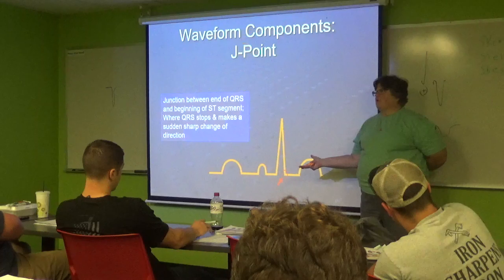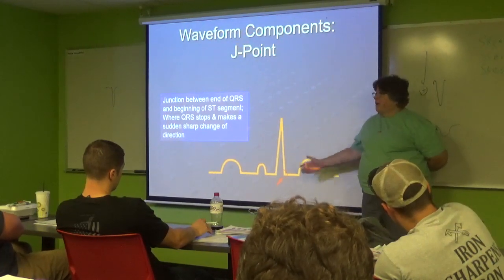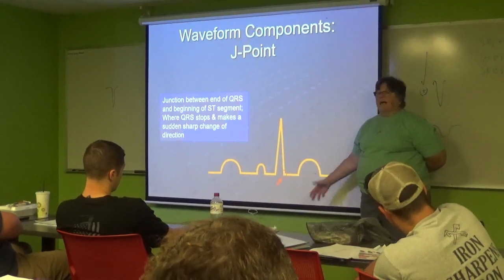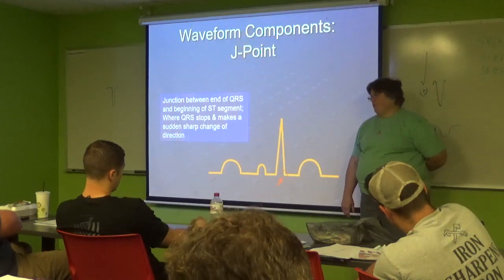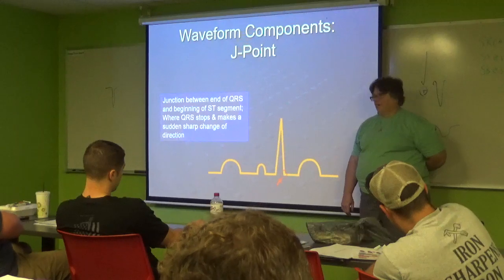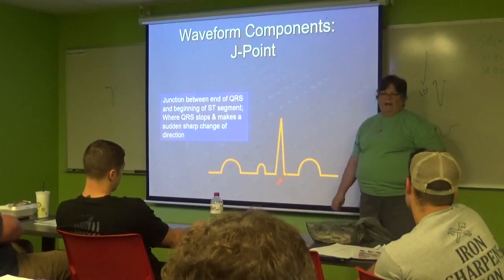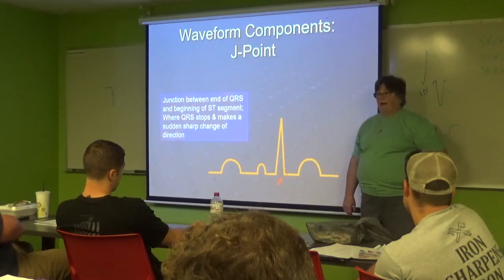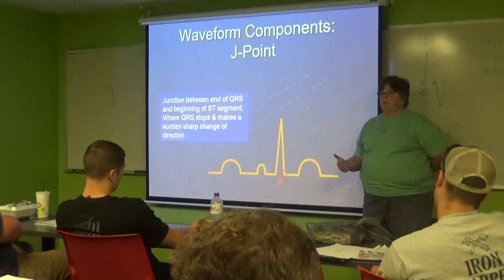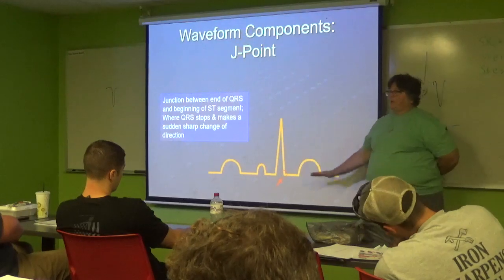That's another MI that gets called in all the time. That's pericarditis most of the time. We have 26-year-olds coming in with heart alerts attached to them. I guarantee it's pericarditis. See it all the time. 26-year-olds don't have MIs 99.7% of the time. There are those every blue moon, but for the most part, 25-year-olds don't have them. So if you're calling an MI on that, it's either they've induced it with a cocaine overdose kind of thing, that could make sense, or you're reading your EKG wrong. And most of the time, it's got your J point matching up to something else.